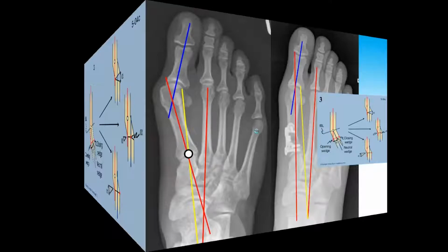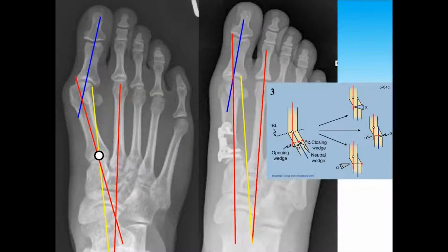I'm not saying base wedge is not a good procedure, but in this case, the osteotomy was made distal to the CORA. The CORA, or apex, is at the Lisfranc joint, but the osteotomy is distal. So you have to translate, as I mentioned before. How much do you translate? It's at the level of the osteotomy, the millimeters between the yellow and blue, or yellow and red line.